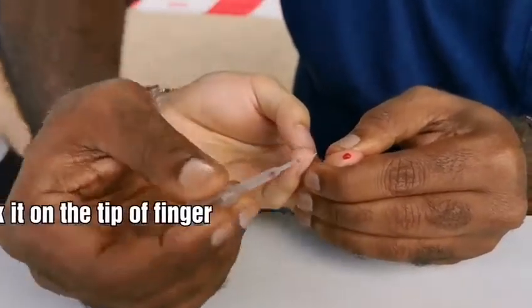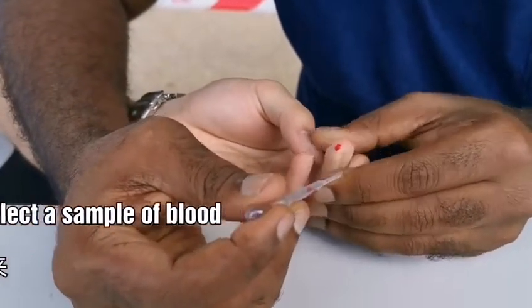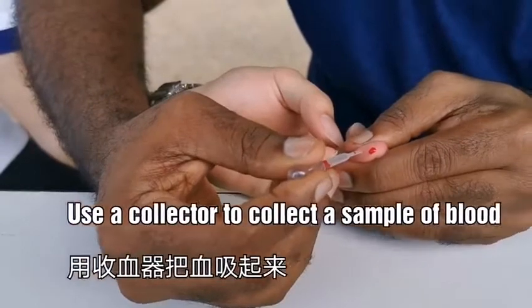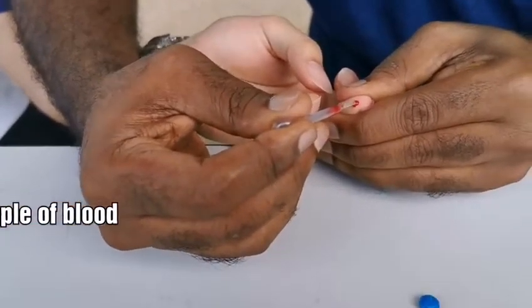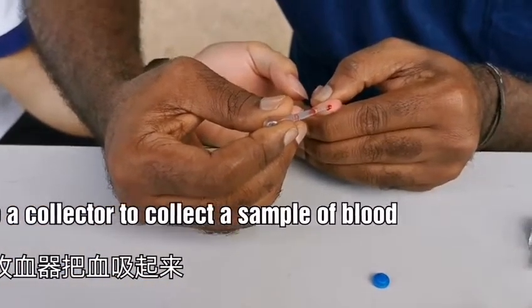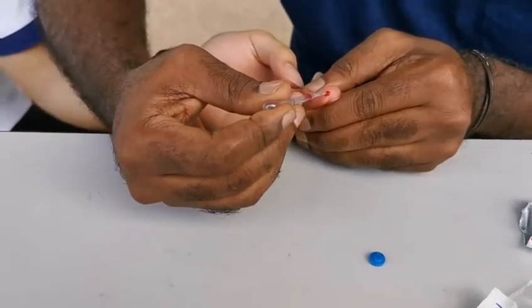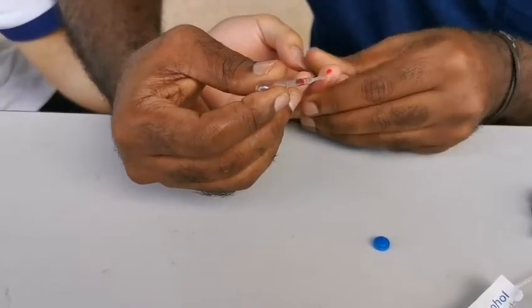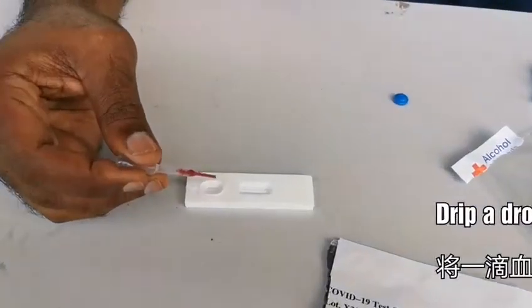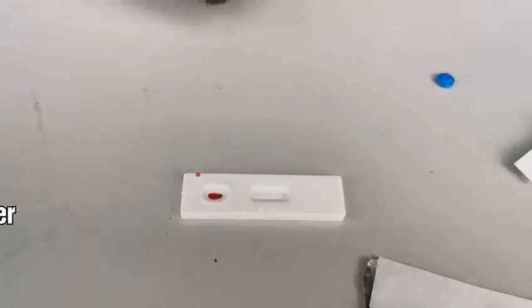We will collect the blood from the tester's finger, drop it onto the test kit, and then put the solution onto it.